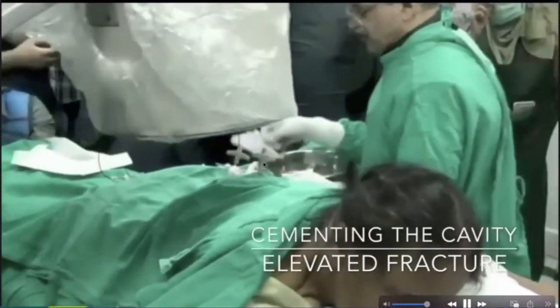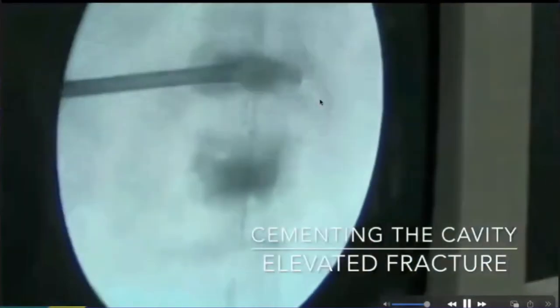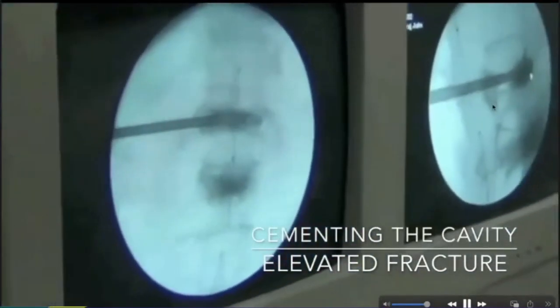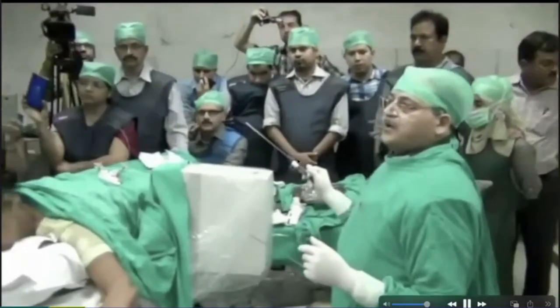This is a very different technique to that. And I do it sometimes and my needle gets choked, you know, it doesn't allow more cement going in. And that is how, in AP lateral, keep seeing both views. Keep one view preserved on the other side when you change your views. So you should have both views, AP and lateral, coming in the view. And you take more cement in now and start injecting in there thereafter.